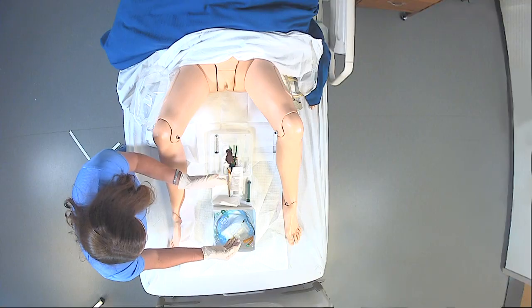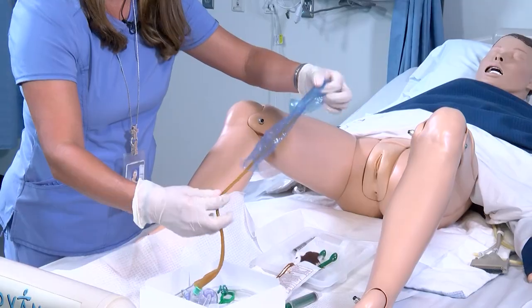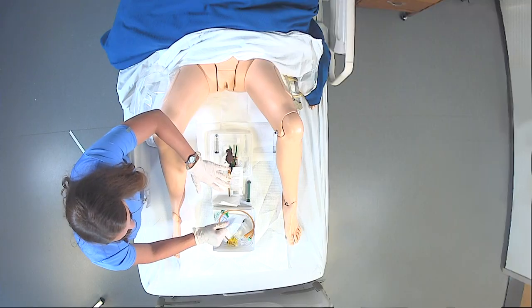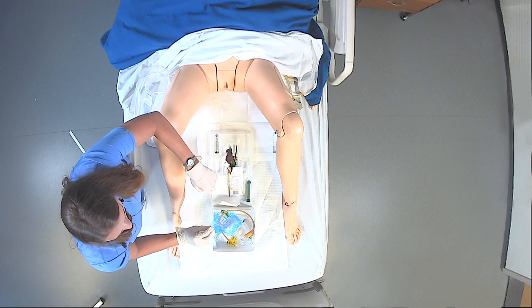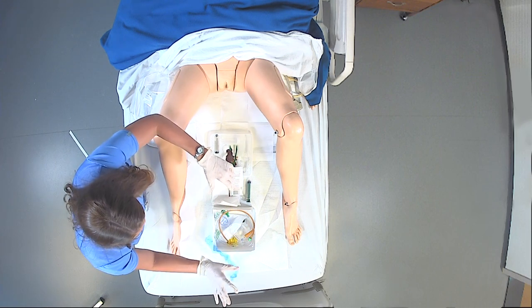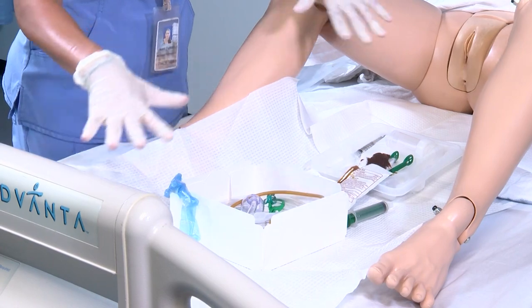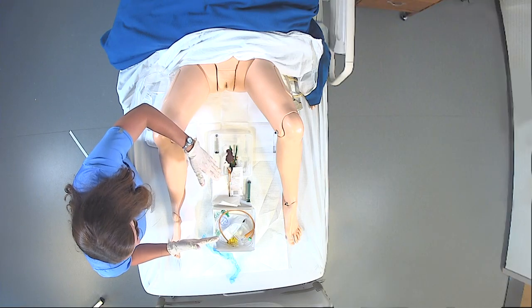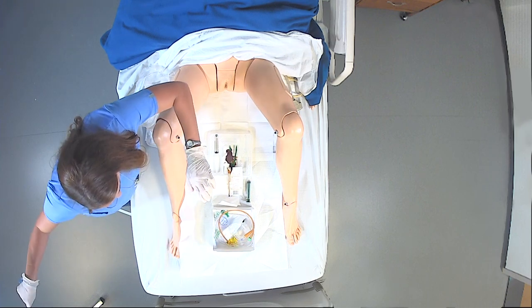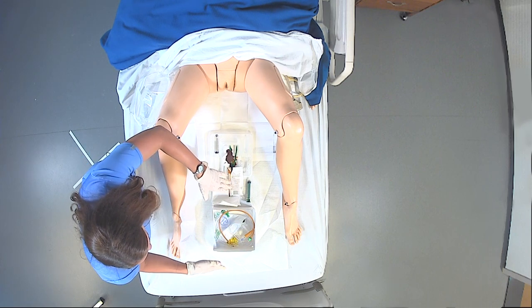When you start your Foley catheter, you take off the blue packaging and a common thing people like to do is throw it down on their sterile field, which is fine. If I put it here, that is perfect because it is still sterile. But if I throw it off my field slightly where it's on and off the field, it's contaminated the whole package and I would have to start over. Make sure it is either completely off the field or stays on completely, not touching that one-inch border.